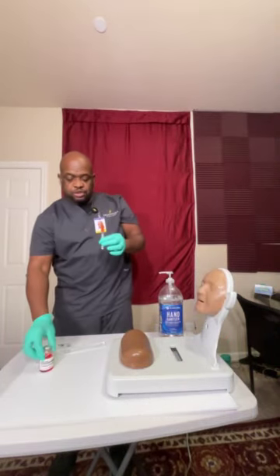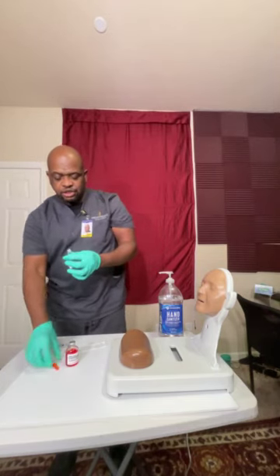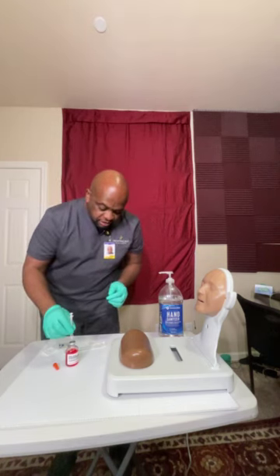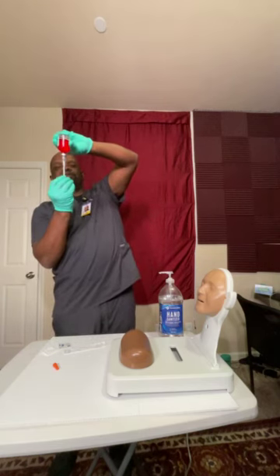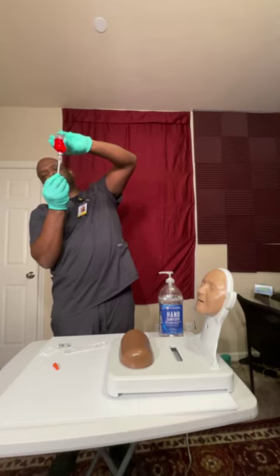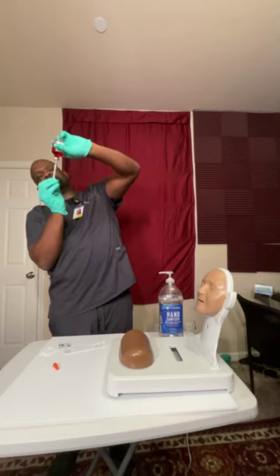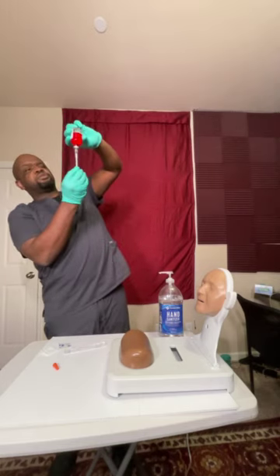Now, I'm going to remove the cap. And I will now inject 0.1 milliliters of air into the medication bottle. Inject the air. Now invert the bottle and draw into the syringe. Pull in 0.1 milliliters of tuberculin medication. So let me make sure I got that there.